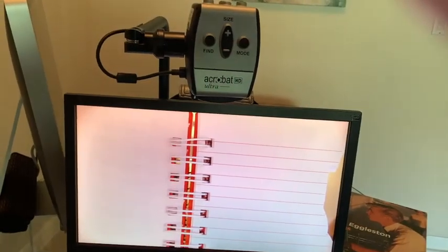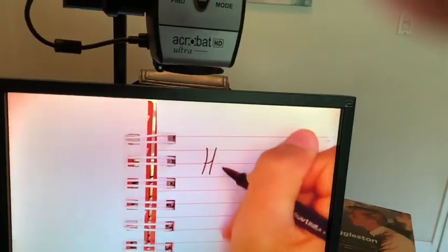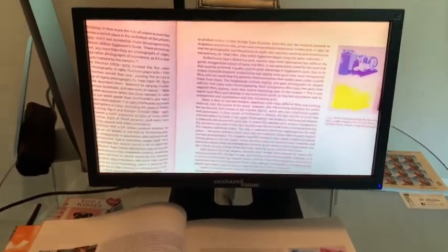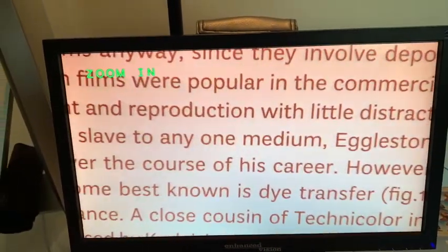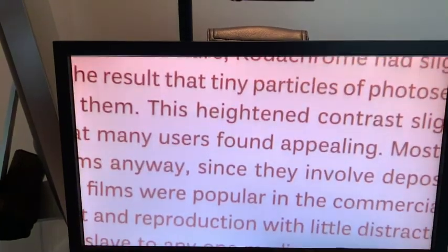It's also possible to do some writing underneath the camera. Here's an example of what a textbook might look like or some other reading material. As far as increasing magnification, let's see what it looks like. Pretty nice.